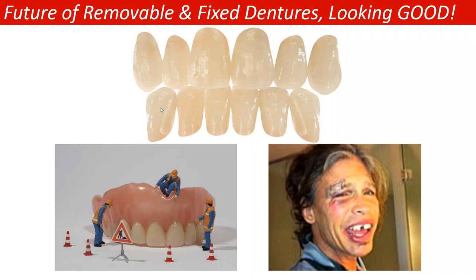The VITA teeth that we fabricate, we've had them out for decades, and we do not get calls about fractures. It's one maybe out of 100, and it's always an individual tooth. Usually a lateral, usually a lower, could be an upper, but it's just that one tooth. If everything's equal, why does an individual tooth fracture and not all anteriors? The reason is because there's interference. There needs to be an adjustment. Maybe the denture is not fitting correctly. Maybe it's moving on them. Maybe the patient has undiagnosed parafunctional habits and so forth.